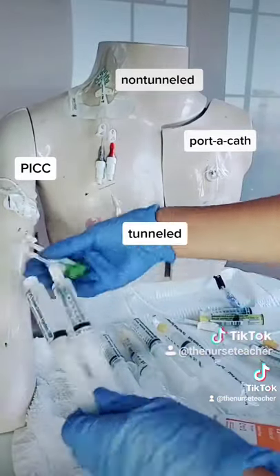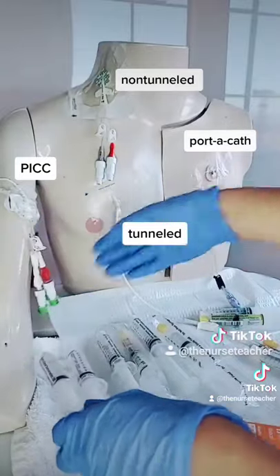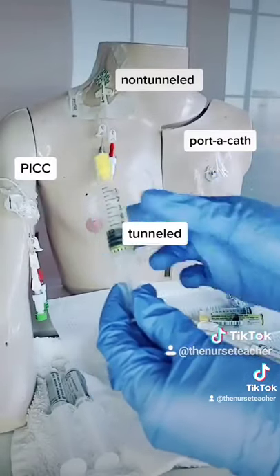All of these have different flushing and locking requirements depending on the manufacturer and the length and gauge of the line. Many PICCs no longer need heparin for locking. If a central line does need heparin, the volume depends on the manufacturer and type.